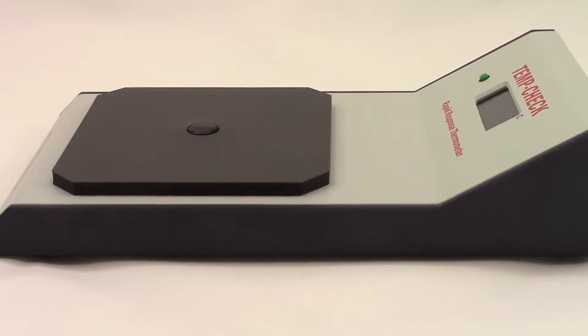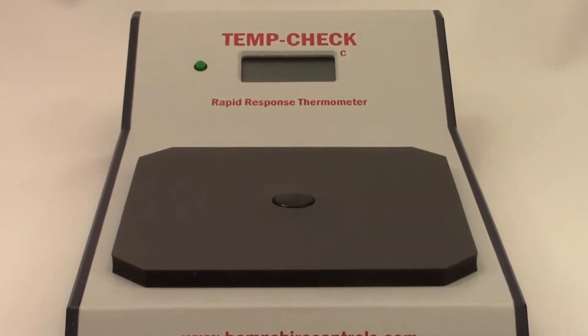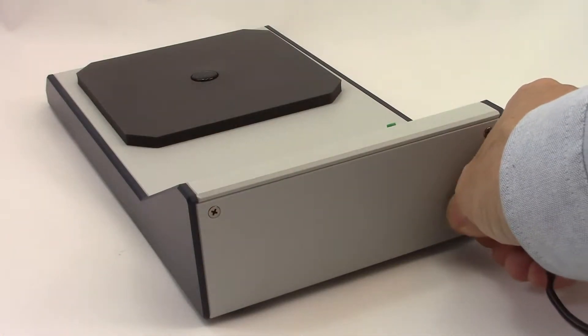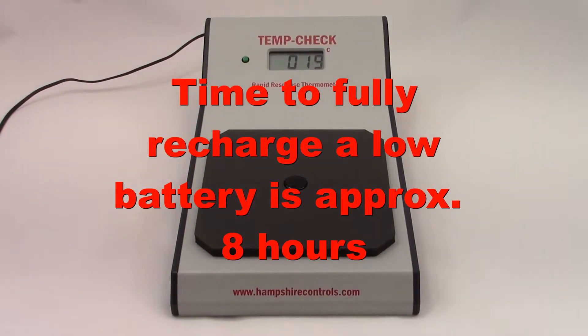To use the portable battery feature, press the button to the left of the display. The TempCheck will stay powered on for two minutes before automatically shutting off to conserve power. The battery will recharge when the unit is reconnected to line power. The time required to fully recharge the battery is approximately eight hours.